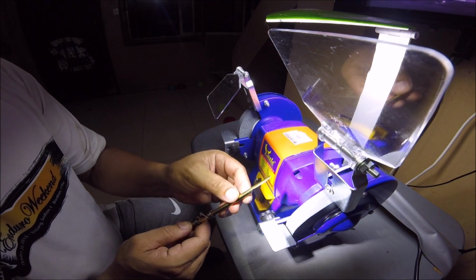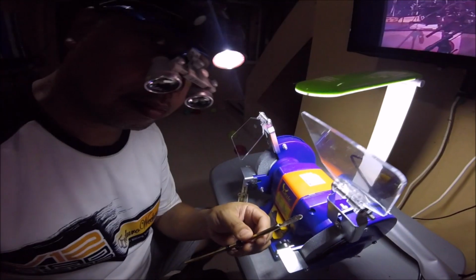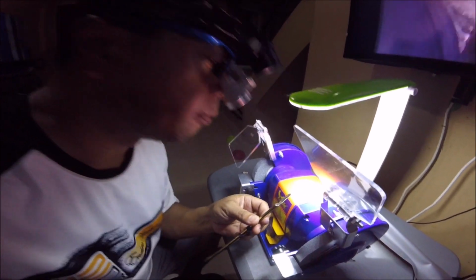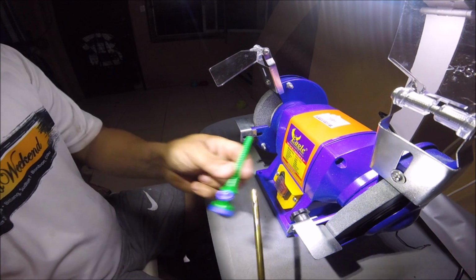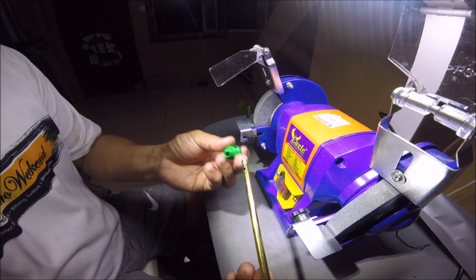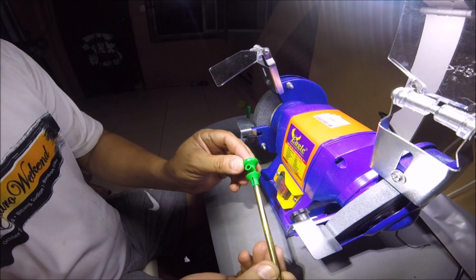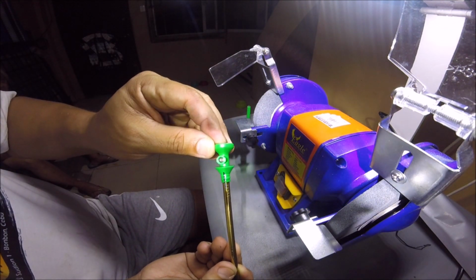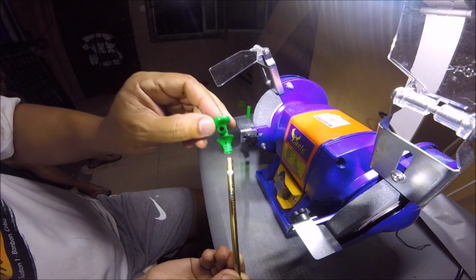Wider than the last one. Okay, now I created this flute hole because I'm going to use this. I want to be able to introduce water into this. So it's going to fit like this. I'm going to epoxy it, and as you can see, the hole, the port for this just basically matches that one.